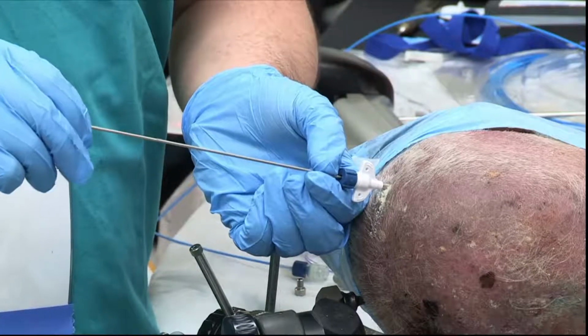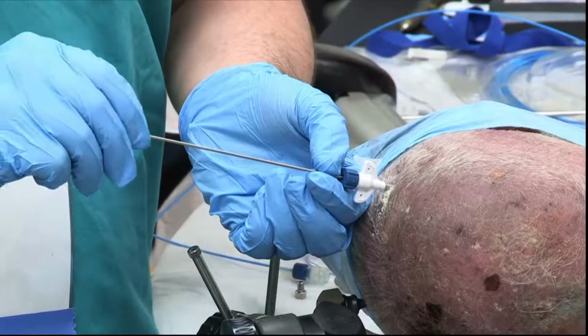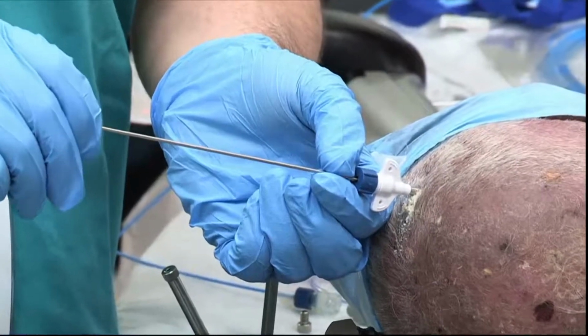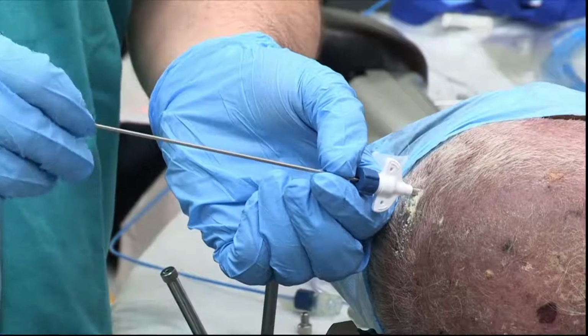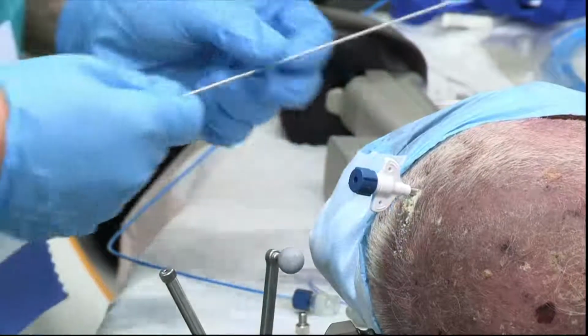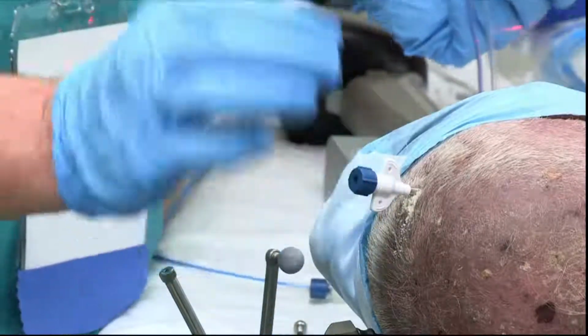And so once we get to target, we're still debating this, whether to do 2 CTs or 1, but there's an option of doing a CT to make sure your trajectory looks good. You can get a CT now to verify that, or you can just get one at the end. So we're set there. We want to loosen this up.